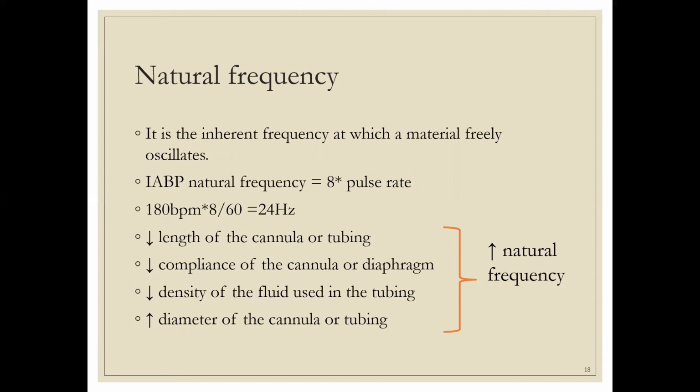Now, what happens is blood is vibrating. It gets transmitted to saline. The saline is vibrating. Then it gets transmitted to the silicon diaphragm. Now, the silicon diaphragm is vibrating. So, this diaphragm has a natural frequency. Blood is having a frequency at which it is vibrating. Now, our intention is that when the silicon diaphragm vibrates, it should vibrate at an inherently higher natural frequency. This would help in better recording and getting even minute details of the blood pressure system.